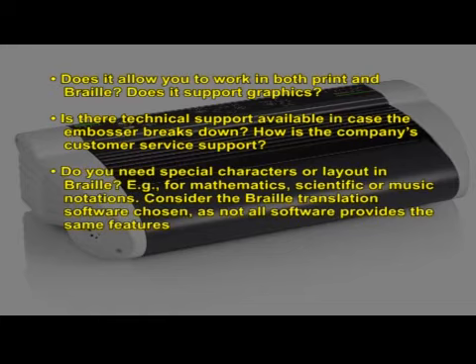Do you need special characters or layout in Braille? Example for mathematics, scientific or music notations. Consider the Braille translation software chosen, as not all softwares provide the same features.